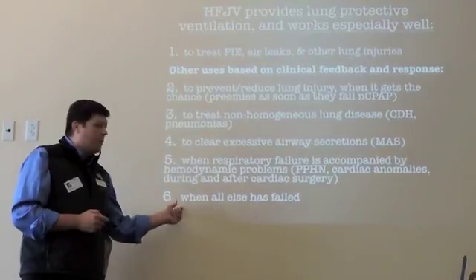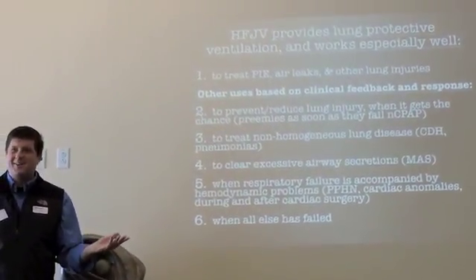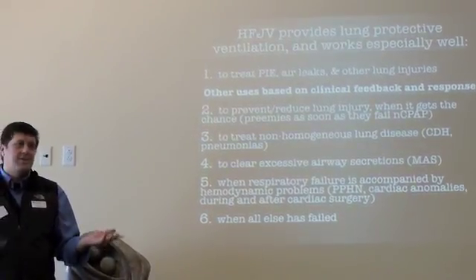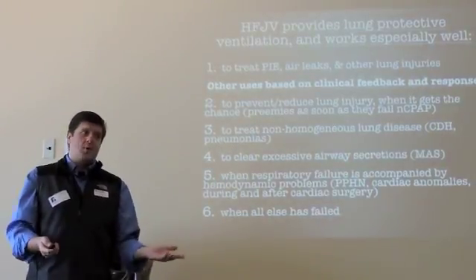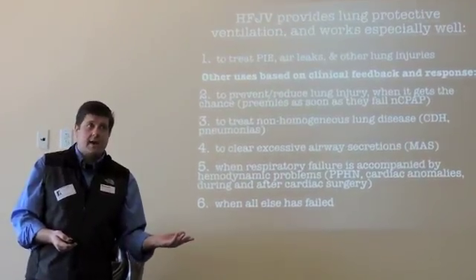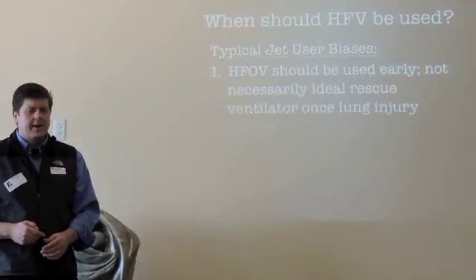And then, when everything else has failed and you don't know what else to do, it's always a great reason to pull the jet out, okay? If you have a kid that's just not responding to anything else and you haven't tried the jet yet, then try the jet. It's different. It may work, it may not, but I don't know unless we try. Okay? And so that's really where it comes from.